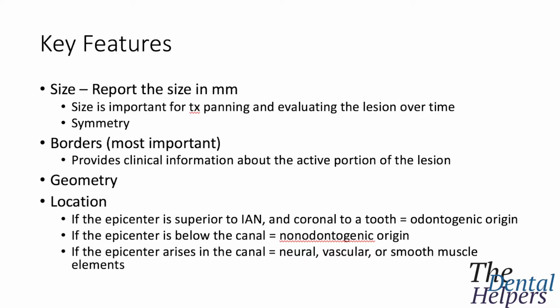When we're talking about size, we're looking at the size in millimeters. So you want to look at the width and height of the pathology you may see, and the best thing is to report it in millimeters. That way you can see if there's any growth. You want to look at the borders. So you want to see if the borders are defined or not defined, and geometric shape.